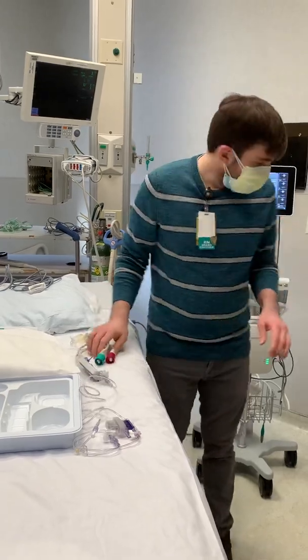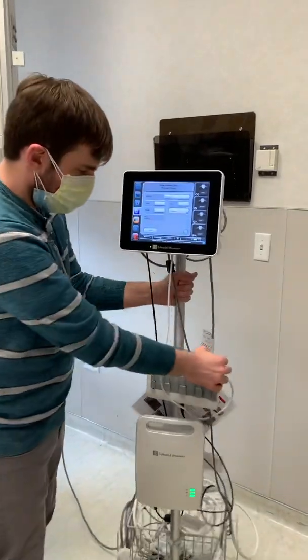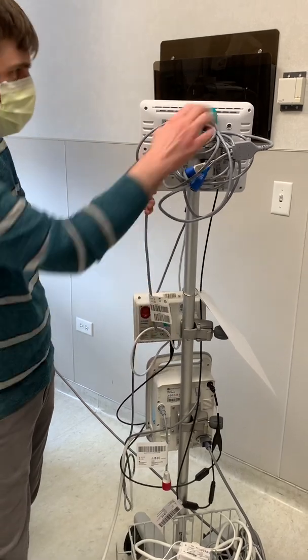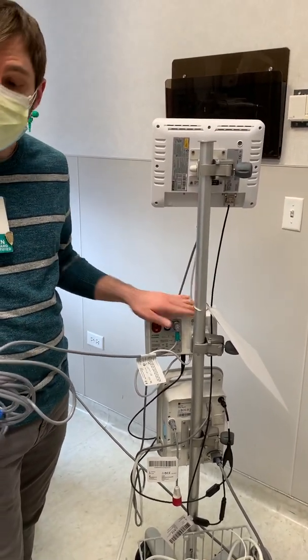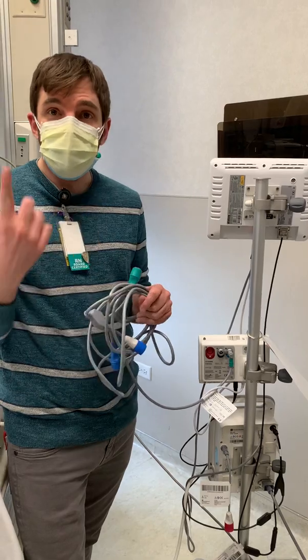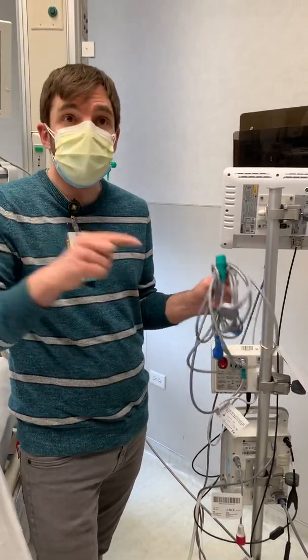This is really pretty easy. I turned the machine on. You have to make sure that you're using the connectors for the FlowTrack part if you're doing the FlowTrack with the A-line. This bottom piece is the ClearSight — that's the one that goes on the finger cuff, and that's a totally different thing. So it's either one or the other.